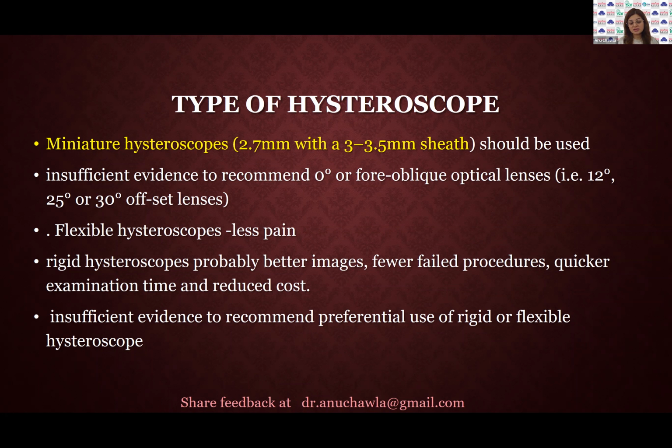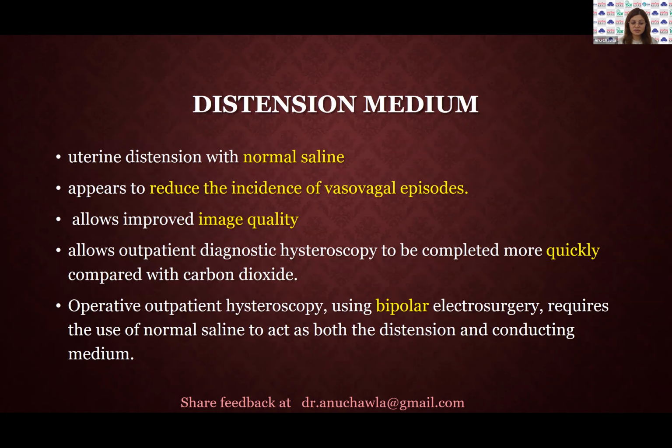But there is another side, that when we use the rigid hysteroscopes, and most of the angled ones are rigid, there are other problems. So when you're doing the office hysteroscope, maybe flexible has a better place, at least in the beginning, because obviously there is less pain. Obviously, it's the choice of the surgeon and how well the patients are taking your particular style of office hysteroscopy.